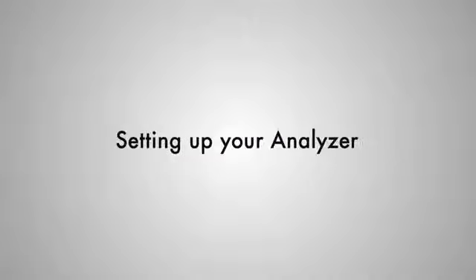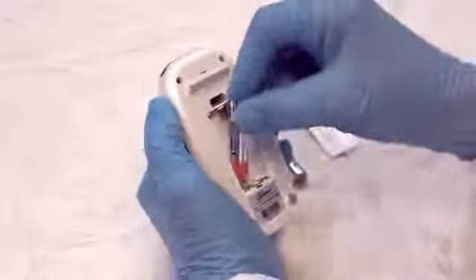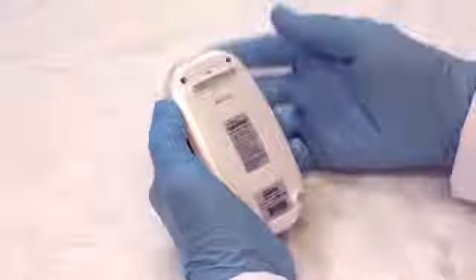Setting up your analyzer. The LipidPlus analyzer requires 2 AAA 1.5-volt alkaline batteries. To install the batteries, open the battery cover on the back of the analyzer. Insert the batteries as indicated on the inside of the battery compartment and replace the battery cover.